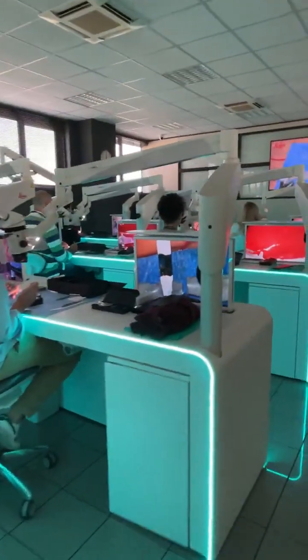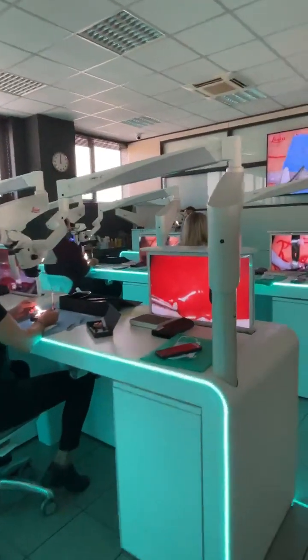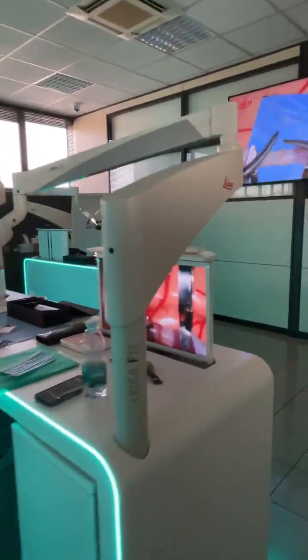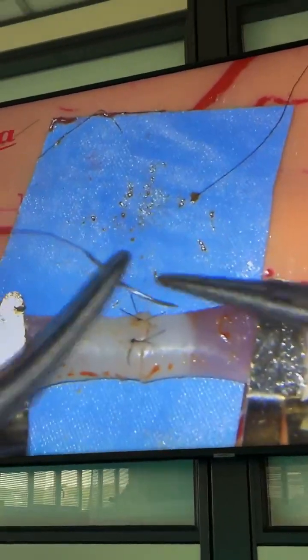You are going to lose the focus if you move your head. Keep your mind focused and stay always on your background position. If you want to see better, don't try to go near the microscope, because you'll lose the focus — always stay on your background. Then open the forceps, pass the suture, and go to the other side.